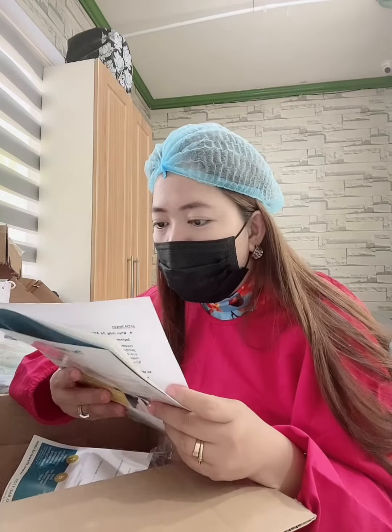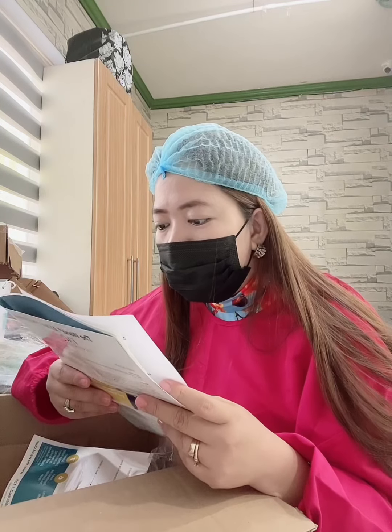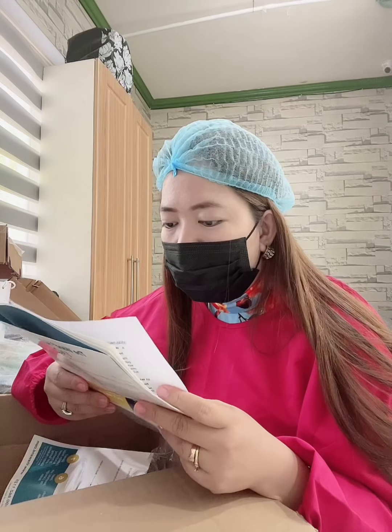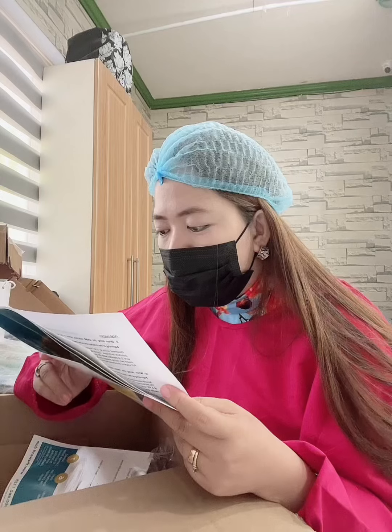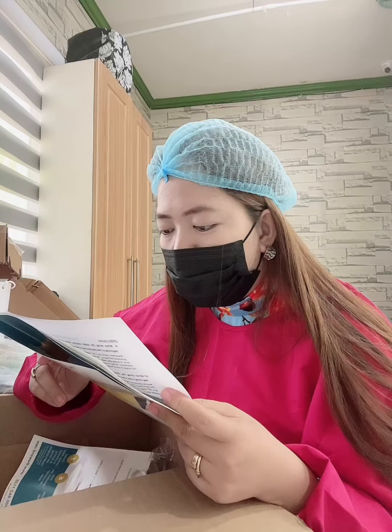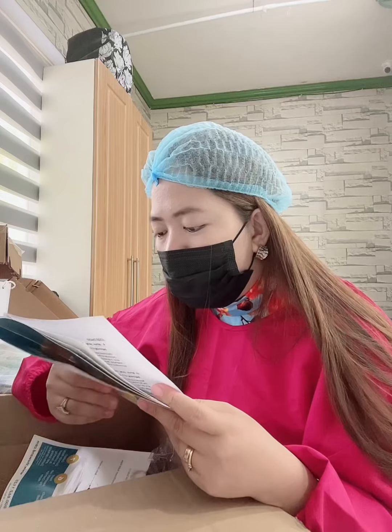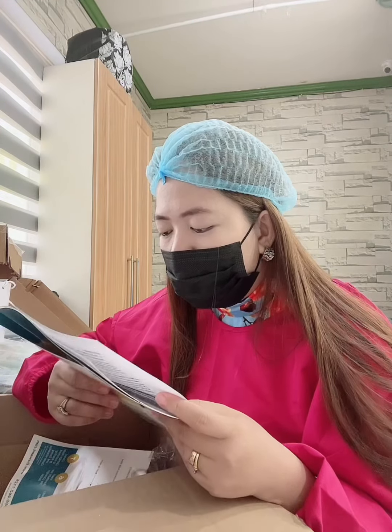These are the common questions most frequently asked. Why do we bend the needle? By bending the needle, the bevel gets placed directly against the tooth surface. Why do you mark the hub of the handpiece? Placing a dot with a Sharpie marker keeps the bevel orientation in your view. How much do you bend the needle? The needle should be bent no more than a 45 degree angle.